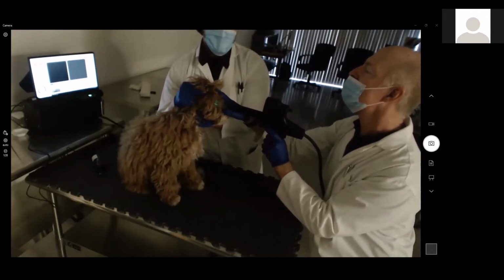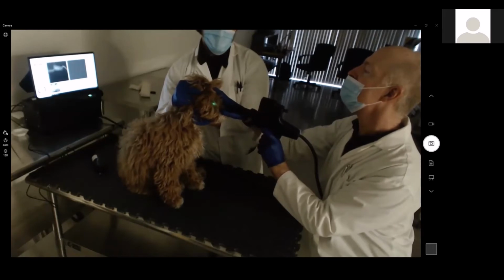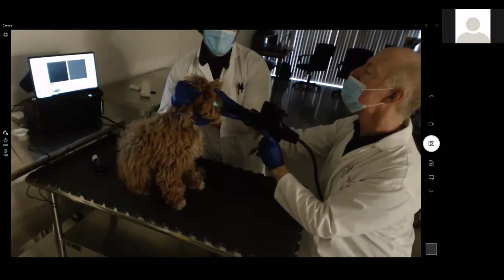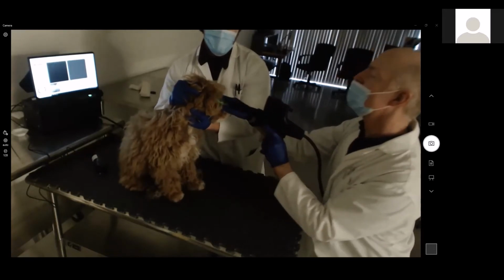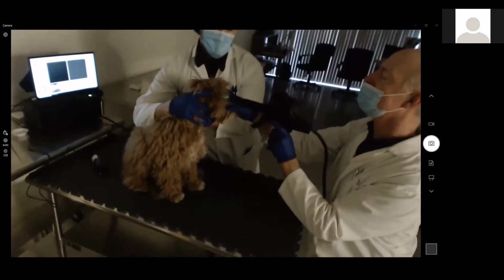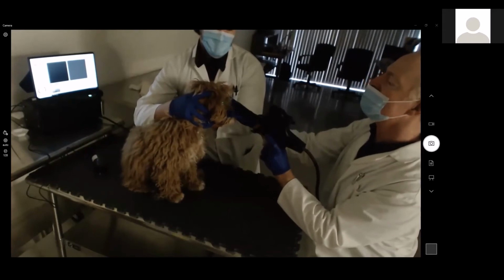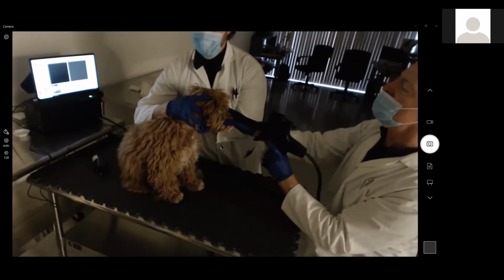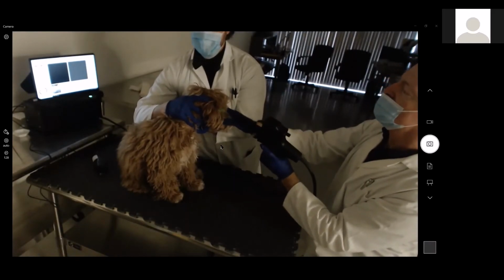Doing good. Almost there. Keep it steady. Thanks. All right, get ready for this. Come on, buddy, you're doing great. Best patient today.